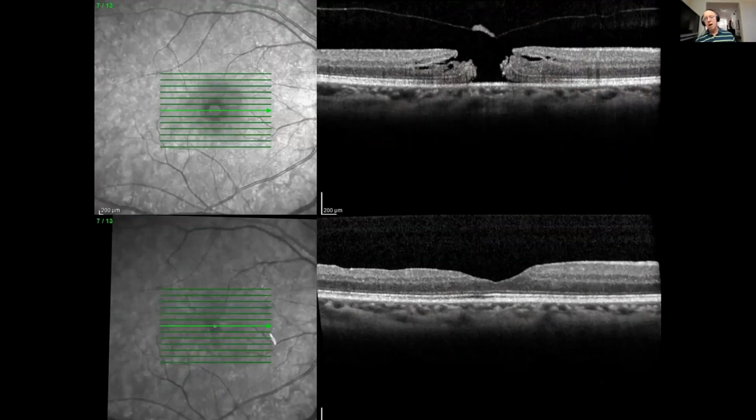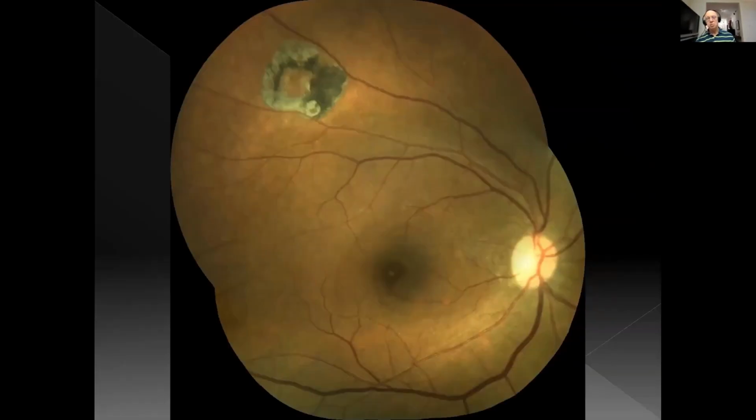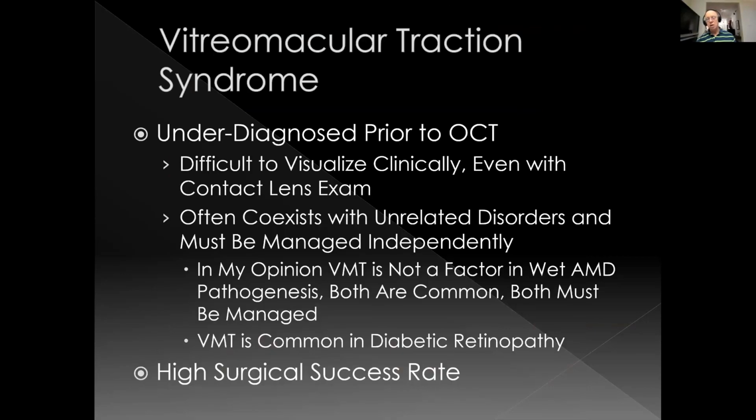Here's another pre-op patient that we fixed. This one, although I did a macular patch graft, I think this had primary closure, so we finally excluded this from the series, and I just wanted to be honest about that point. Another case, again, the donor site superiorly and the graft in place in the macula with improved vision.